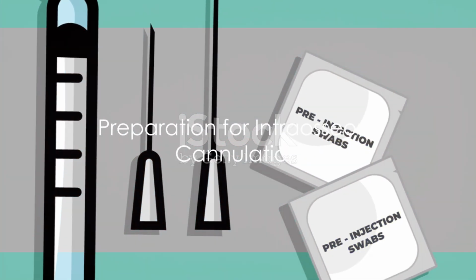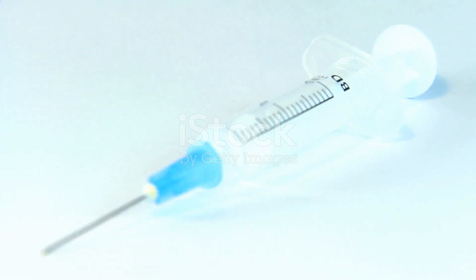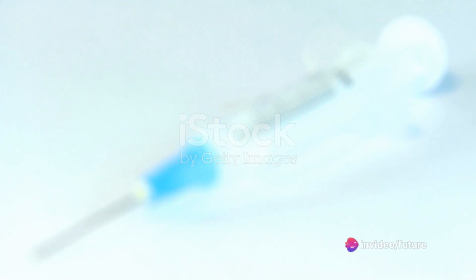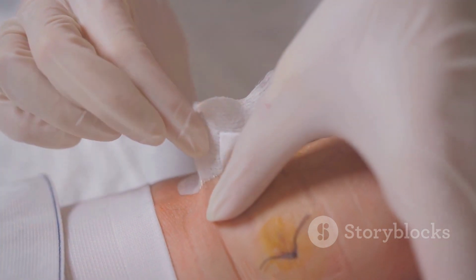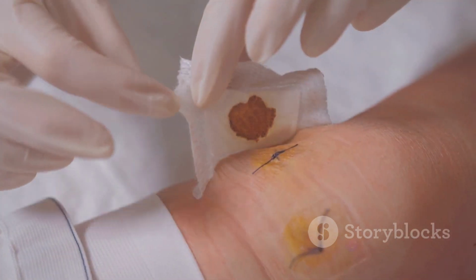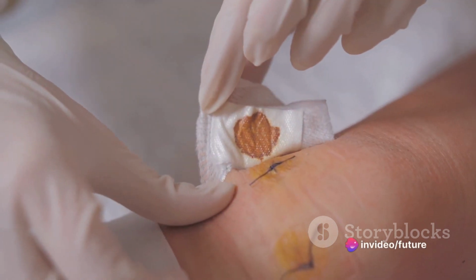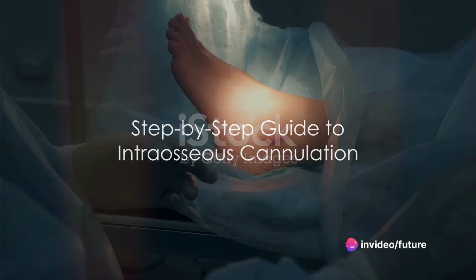Before starting the procedure, gather all the necessary equipment: an intraosseous needle, a stabilization device, alcohol swabs, and the right dressing materials. Always ensure patient consent and explain the procedure if the situation allows. Choose the insertion site based on the patient's age and anatomy, with common sites being the proximal tibia, distal tibia, and proximal humerus. Now here's the step-by-step guide to intraosseous cannulation.